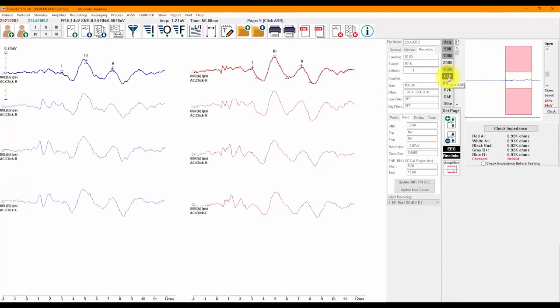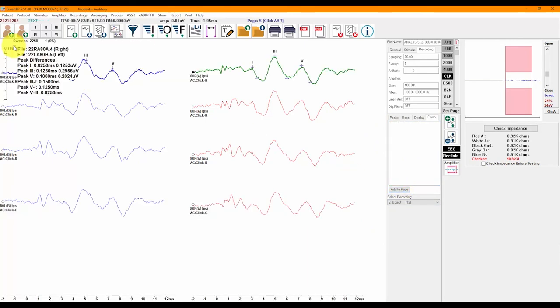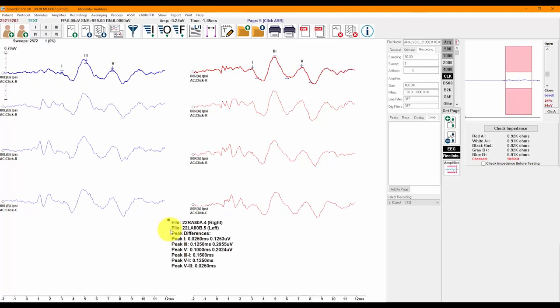Heading over to the Click page to show you how to compare two recordings. First, select one recording by clicking on its circle, hold down the Control key, and select the other — both circles will be filled. Now go to the Compare tab of the Recording Information panel, and you will see the inter-aural differences as well as the inter-peak inter-aural differences displayed. You can click on Add Info to Page to add the information to the page, and click and drag the information box to move it to your desired location.